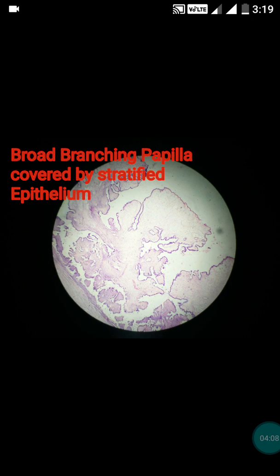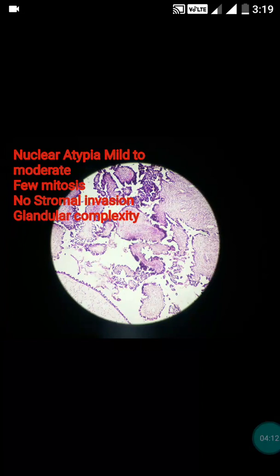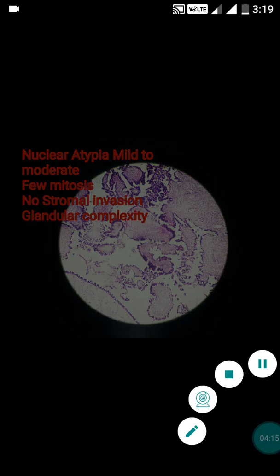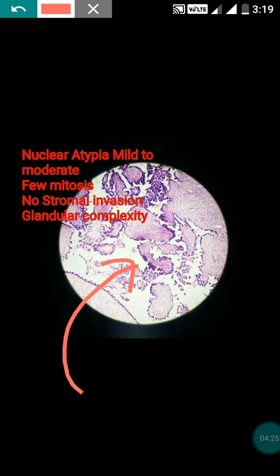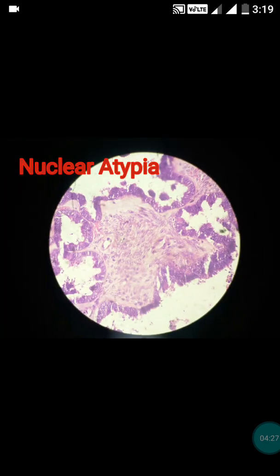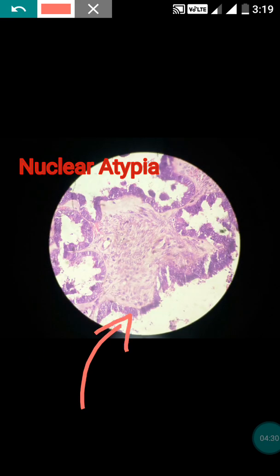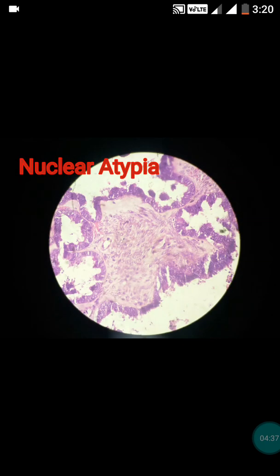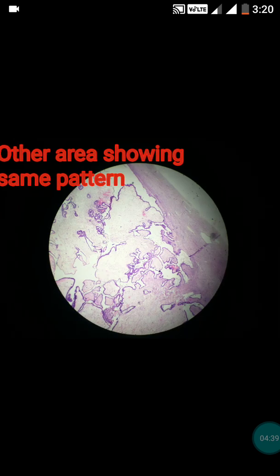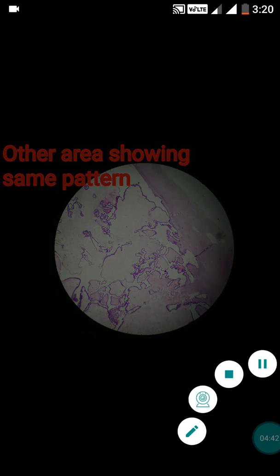These are other features: you can see the broad branching papillae and obvious stratification. Now observing at 20x view, you can see a few mitoses and glandular complexity. There is also presence of nuclear atypia, which is obvious in this figure. Inspecting other fields shows the same pattern — branching broad papillae.